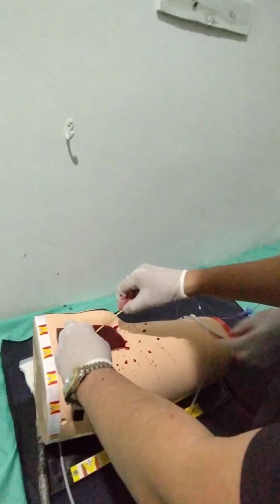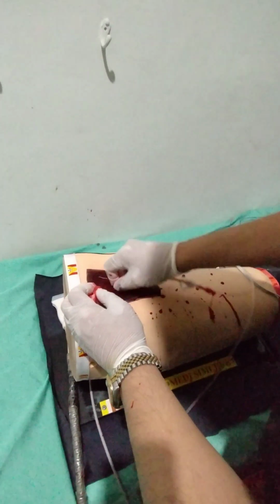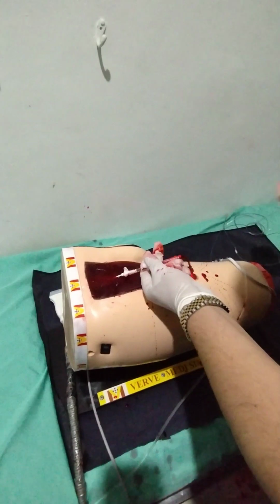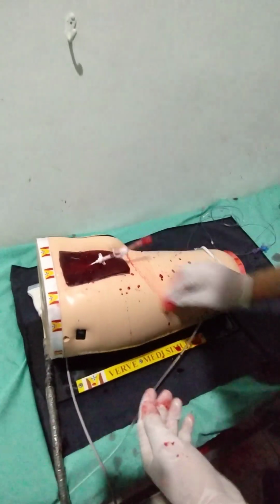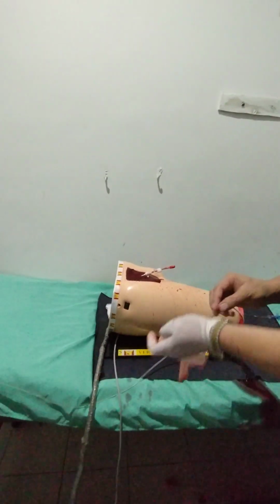So this is shifted so it can go easily. As you can see, it's slightly messy, but the blood is coming. So we have to close. Now let's see in the ultrasound machine.